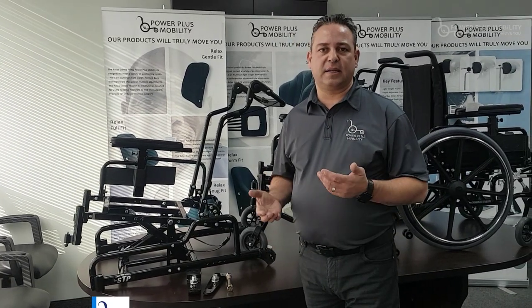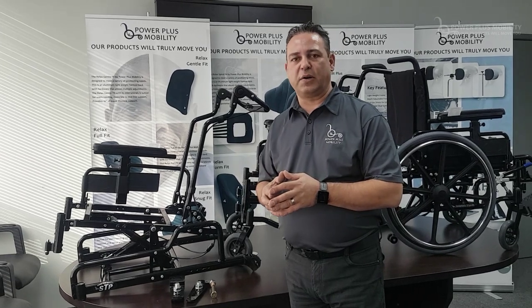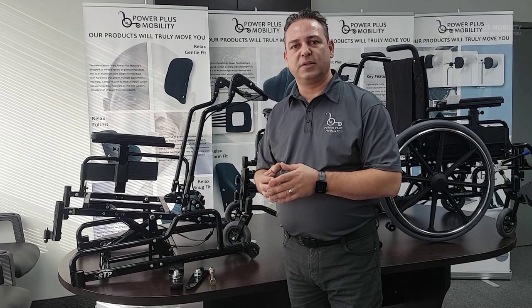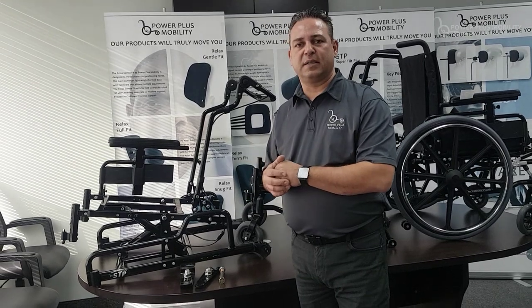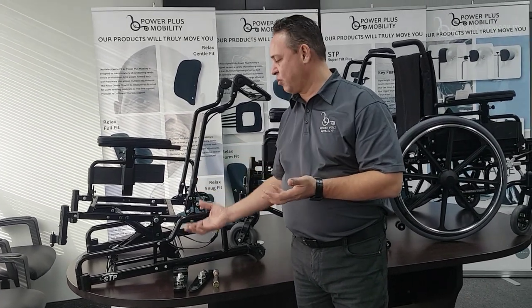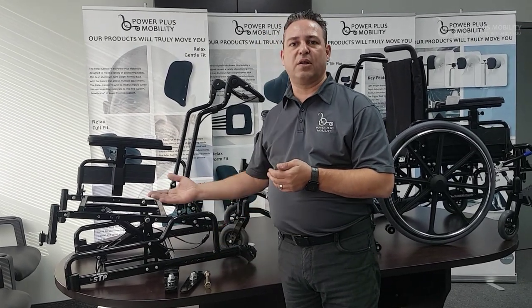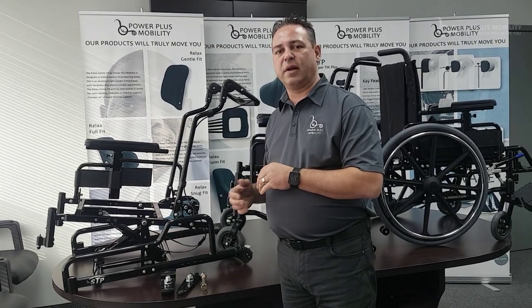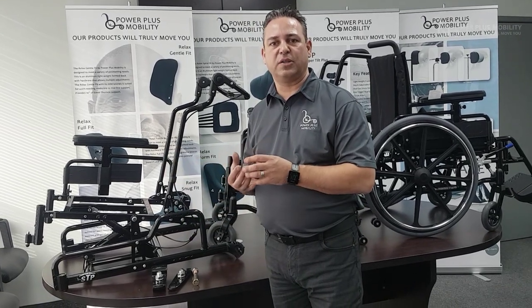Nobody sits at the same seat-to-floor height. There are different torso heights and different leg lengths, so we're constantly measuring the end user and making sure they're sitting in the chair properly and at the right height. Some clients foot propel, so their feet need to be level on the ground to strike and propel. For clients whose feet don't need to be on the ground, we need to raise the frame — either by changing wheel configurations on the front or back, or by having adjustability in the rear axle to adjust the rear seat-to-floor height.